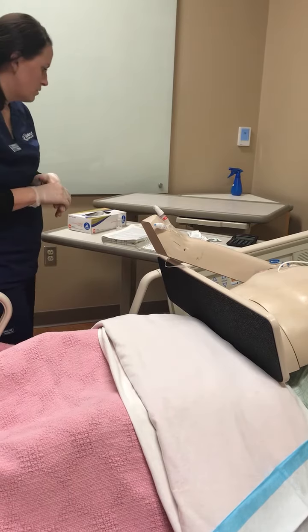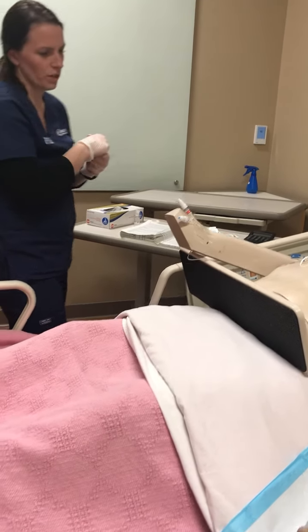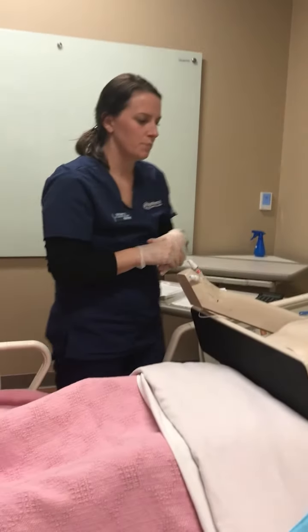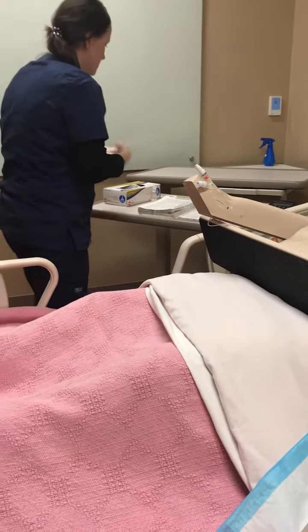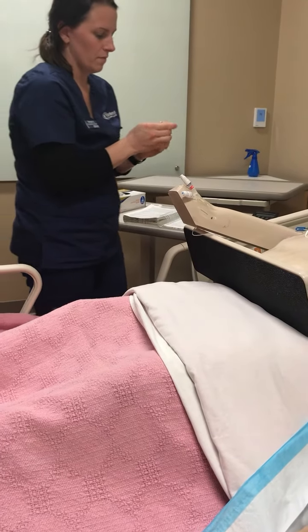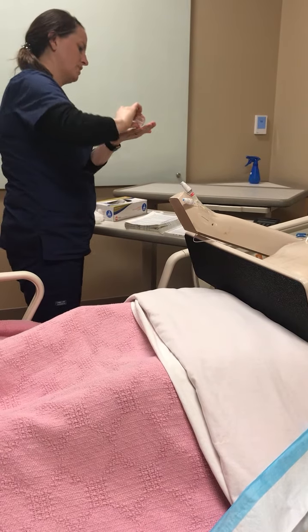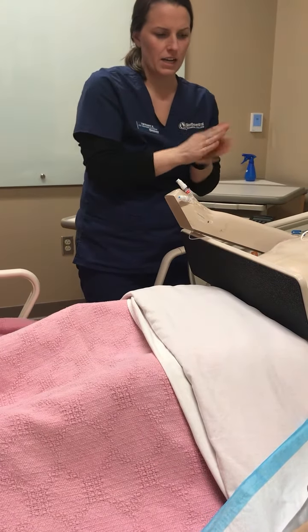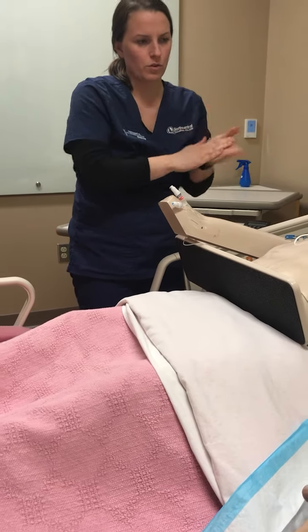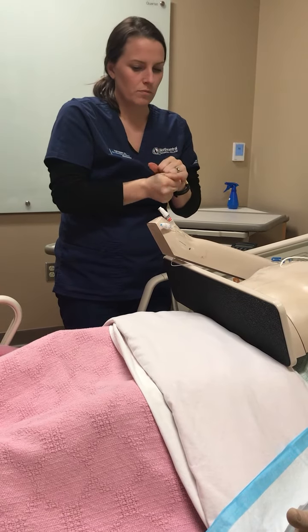So after I've administered my meds, I want to go ahead and take my supplies and get rid of those in the appropriate receptacle. And then I can take my gloves off. I will wash my hands. With this being Zofran, I don't have a lot of concerns. A lot of it is on the rate of administration too.